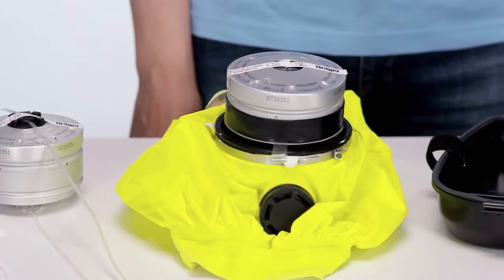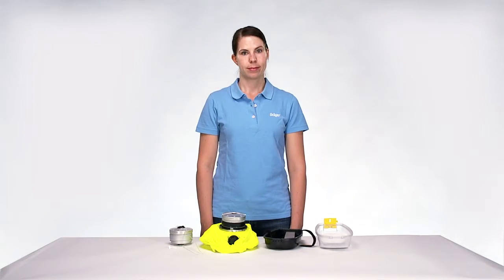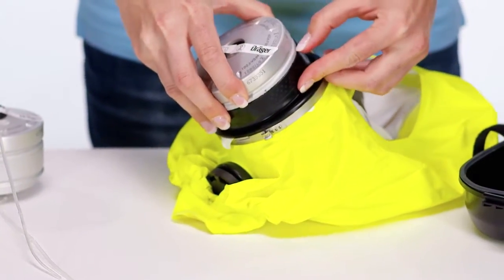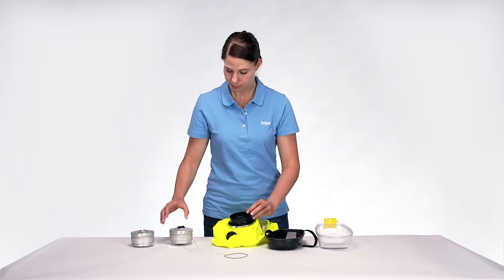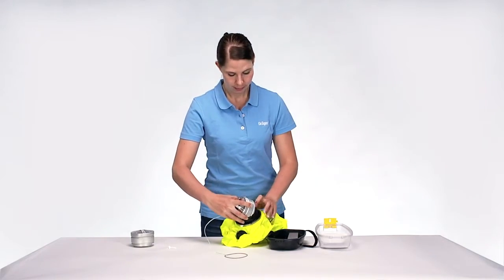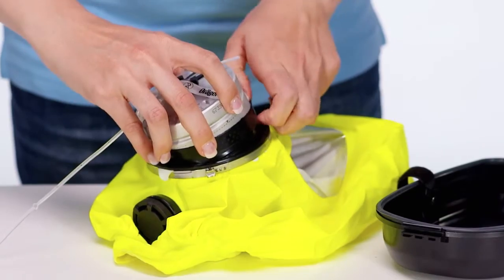To replace the filter, proceed as follows. Open the hard case and remove the hood as described above. Remove the O-ring with tag from the filter. Remove the filter from the half mask. Take the new filter from the spare part set. Insert the filter into the half mask. Mind the preferred position of the filter sealing plug.